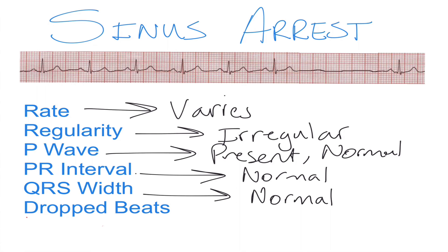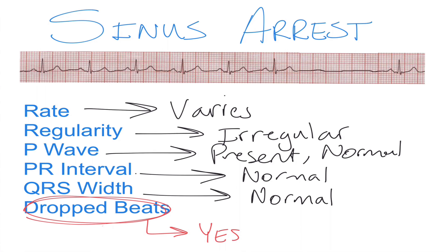From the sinoatrial block video, we introduced a characteristic called dropped beats, and we do have them present here in this rhythm. A dropped beat is a beat that should have occurred but didn't. With sinus arrest and sinoatrial block, we want to look at what's going on with this pause.